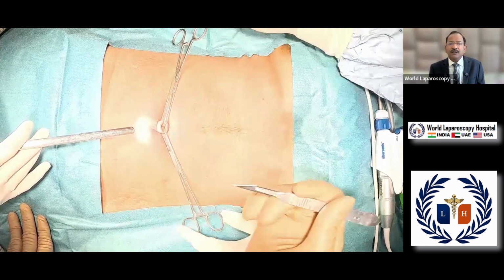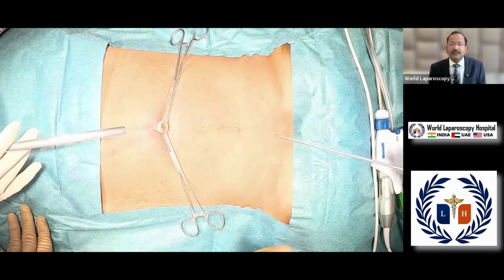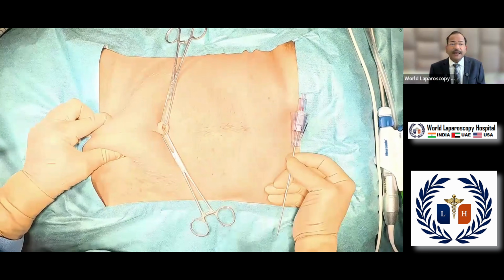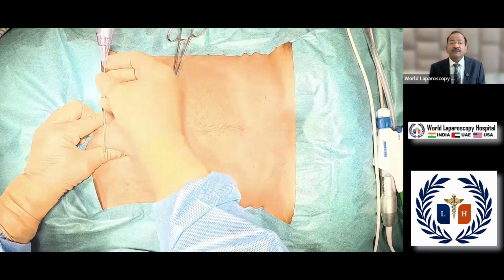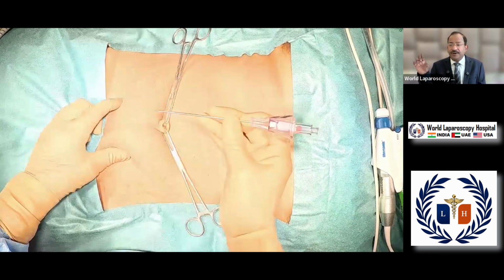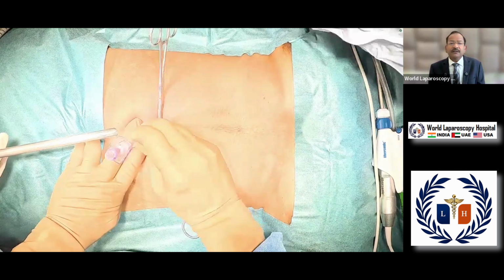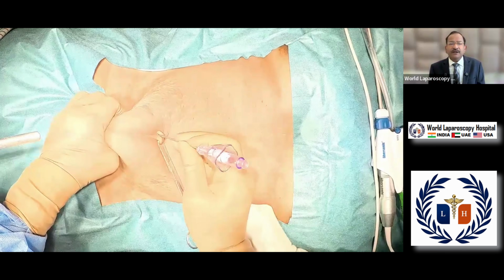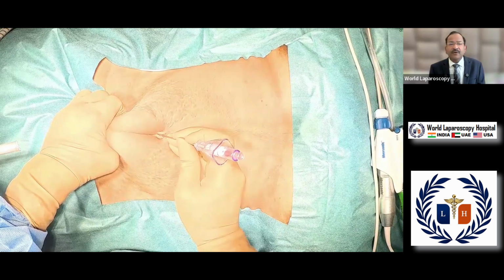And after that, hold the Veress needle like a dart and measure it. And how much of the Veress needle should be naked? 4 centimeters plus the thickness of the abdominal wall, because tenting of the peritoneum requires 4 centimeters, and then it punctures. Then put it into the wound, then lift the abdominal wall with your thenar eminence and all 4 fingers, point towards the anus, and then here you go.